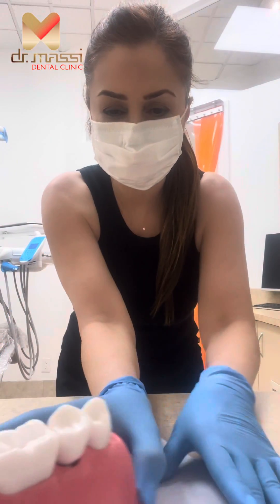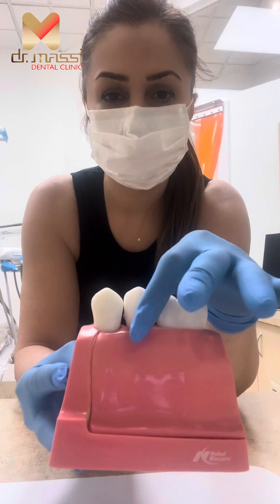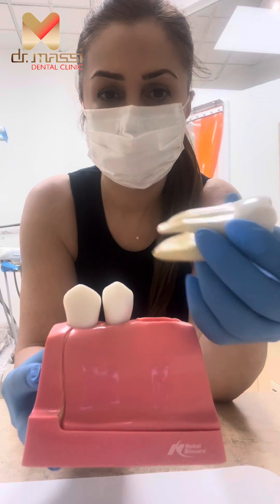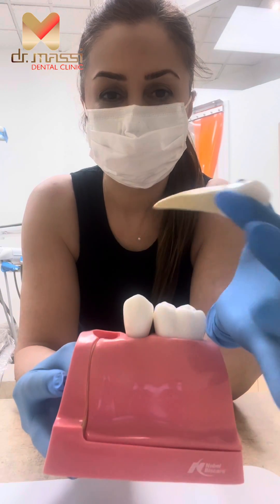Hi guys, I'm going to show you today the dental implant versus the dental bridge. If you look at the middle tooth, it's a crown on top of the dental implant. The adjacent tooth is a molar tooth, and another one is a premolar tooth.